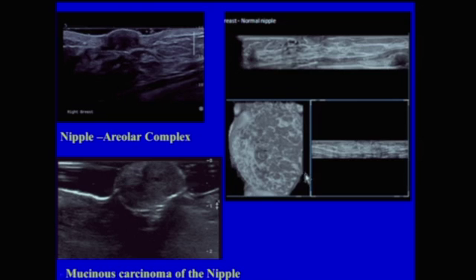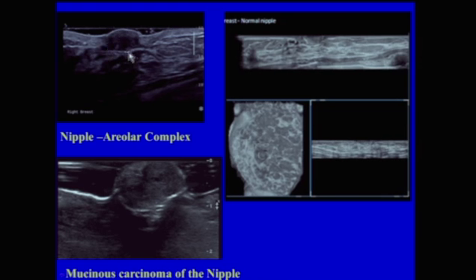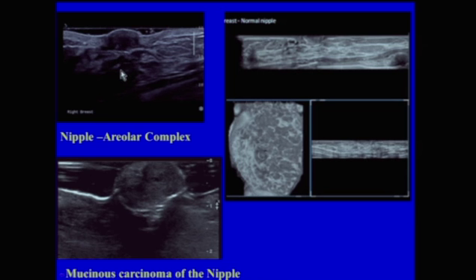The nipple-areolar complex can be difficult to see with ultrasound unless certain maneuvers are used. For example, this is a normal nipple-areolar complex seen well because abundant gel was placed between the nipple and the transducer. The nipple is seen as a hypoechoic circumscribed mass and the skin layers are well seen as two echogenic layers separated by a hypoechoic area. Using this technique, you can see the area behind the nipple very well. Without gel or an offset pad, the nipple can cause posterior acoustic shadowing, obliterating visualization posterior to the nipple.